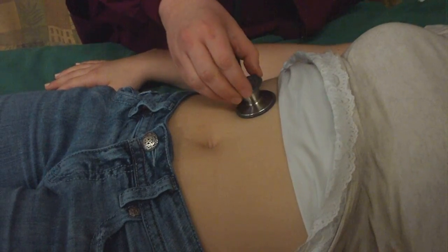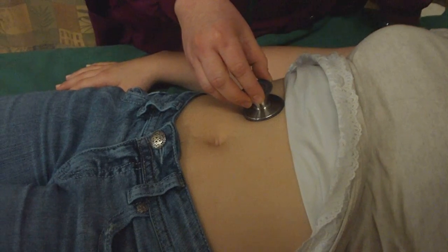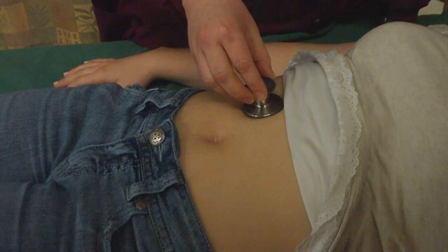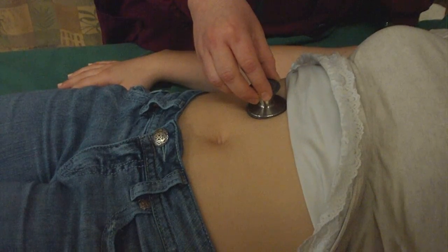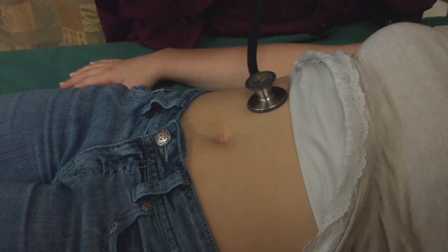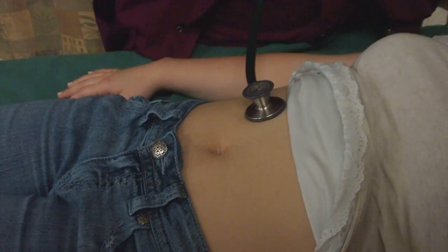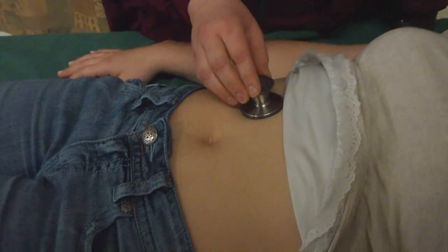and I should really pretty much right off the bat hear a little bit of bowel sounds. Sometimes it takes a little bit longer to hear something, so you have to wait and hear it. If you really are not hearing any bowel sounds at all, you have to wait 5 minutes before you can call it absent. And then I would always have another nurse come and listen as well.